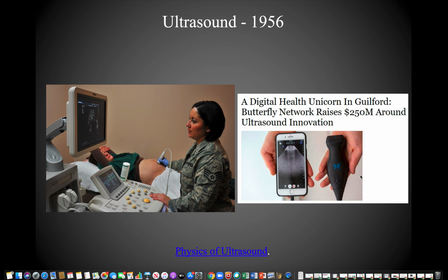You can see an example of one of those over here on the right. You can plug it right into your smartphone. Primarily iPhones have the majority of these probes that work. So you think about an ER physician, resident, etc. They can simply plug it in, and then they have this immediate ability to scan anybody anywhere within the hospital. So it's very rapid, very quick, and very easy to use.